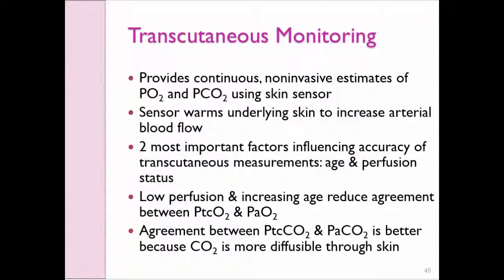Transcutaneous monitoring. What does that mean? That means across the skin, right? And now we're also talking about monitors, not analysis. So it's a non-invasive form of evaluating blood gases. These transcutaneous monitors provide continuous non-invasive estimates of PO2 and PCO2 using a skin sensor.